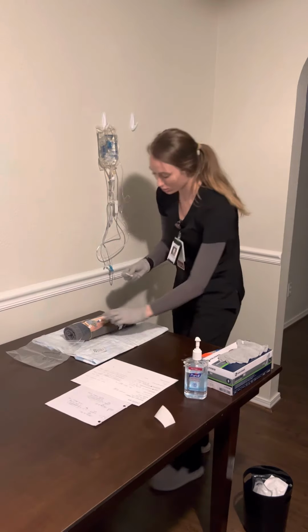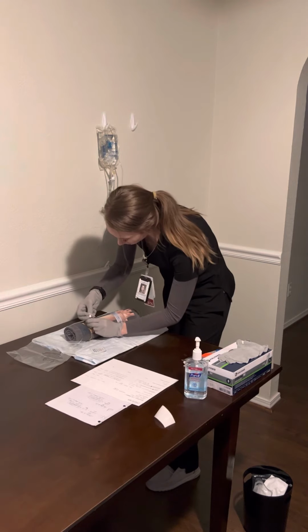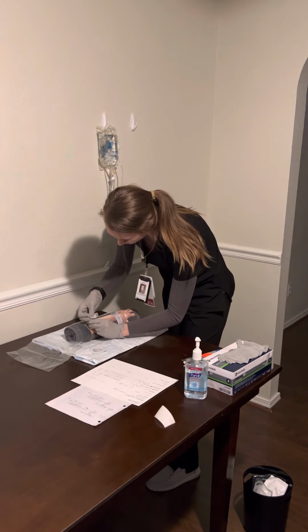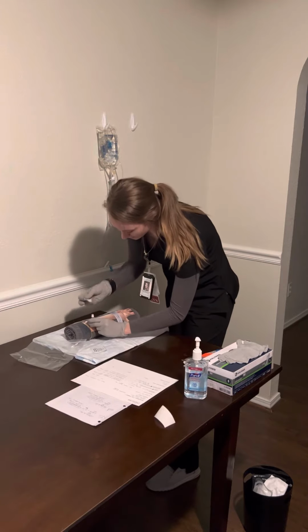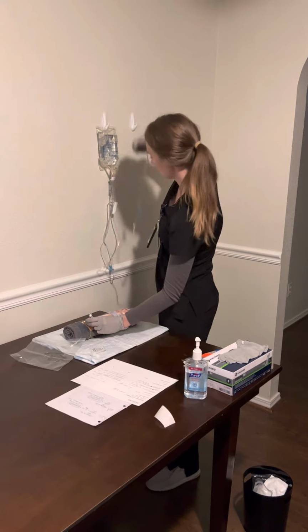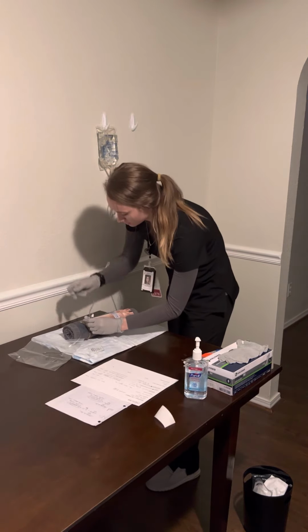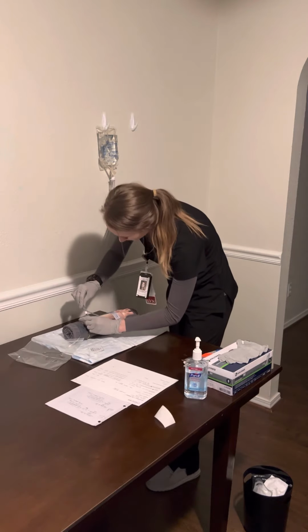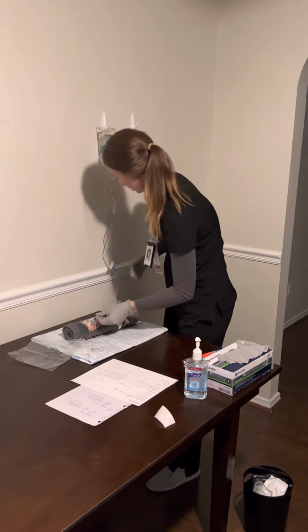So I'm gonna grab an alcohol swab and vigorously scrub the needleless connector. That's now clean, so I'm not going to let it touch her skin. I'm going to remove the cap from the end of the tubing and connect the two. That is secured. I'm going to remove my gloves and wash my hands again.